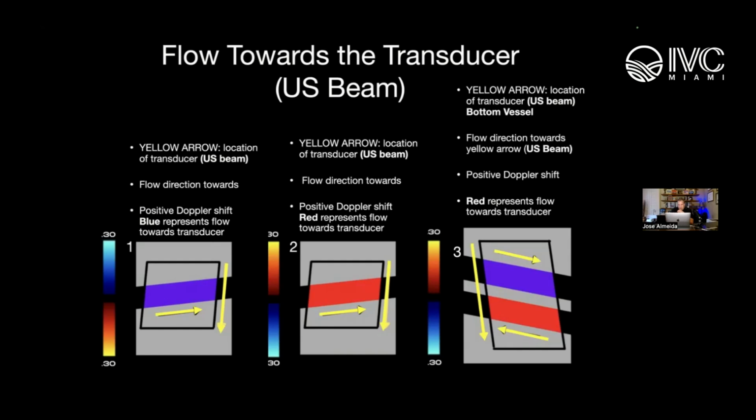So you've delineated there that yellow line pointing down as home. That's where the transducer is. And then if you look at the color bars, on some of them, the blue is on the top, and on others, the orange is on the top. But that also doesn't really tell us where the head or the foot of the patient is.